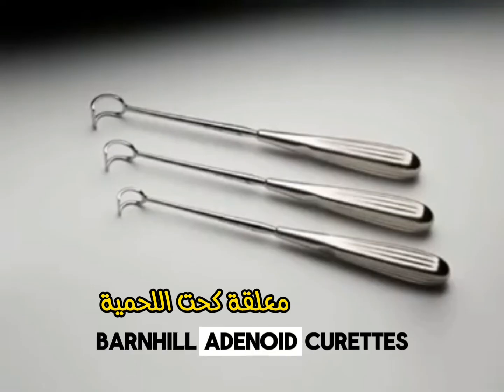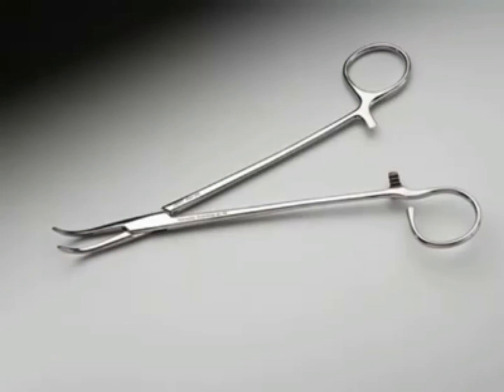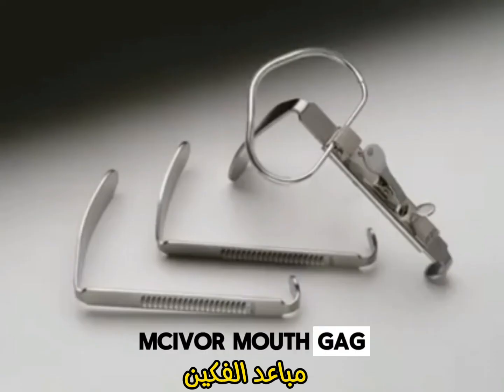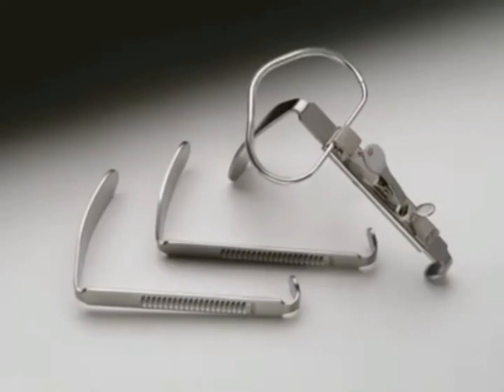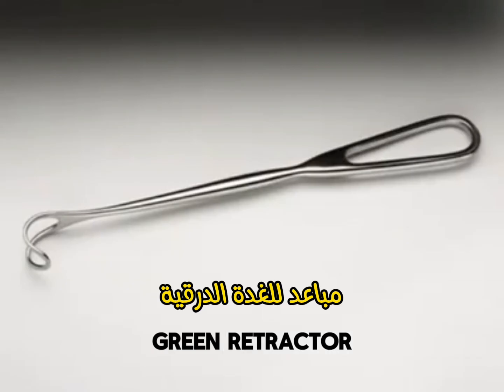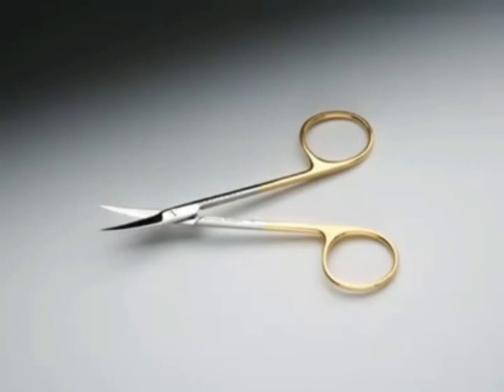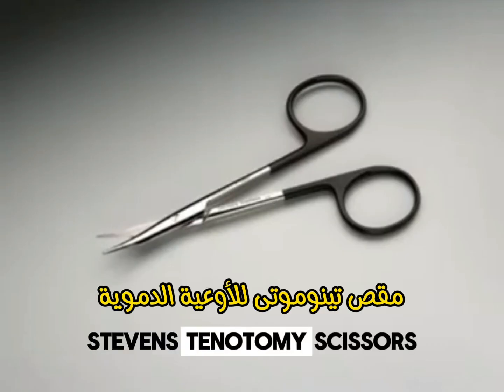Barnhill Adenoid Curettes. Schnidt Tonsil Forceps. McIvor Mouth Gag. Green Retractor. Iris Scissors. Steven's Tenotomy Scissors.